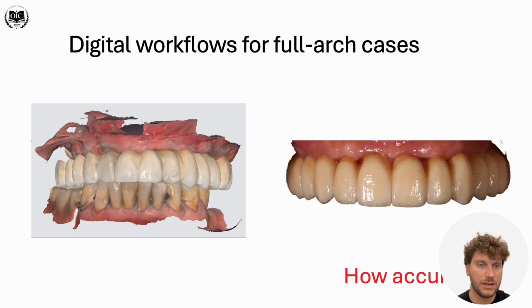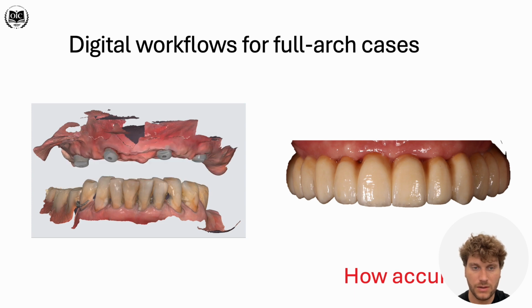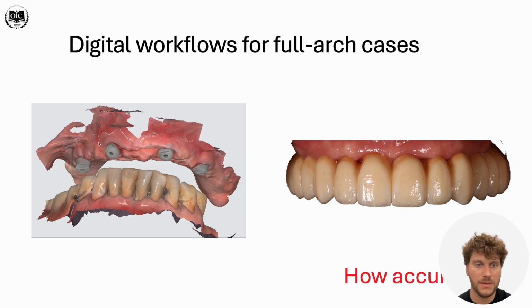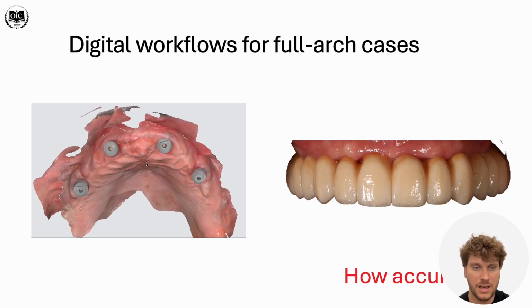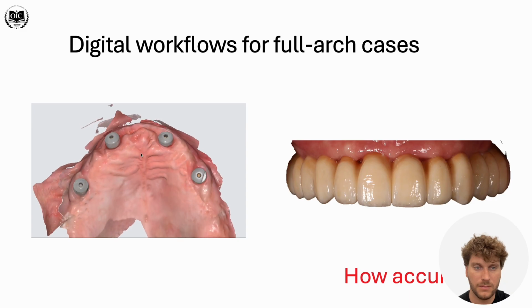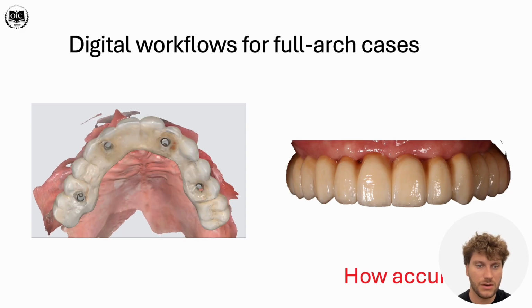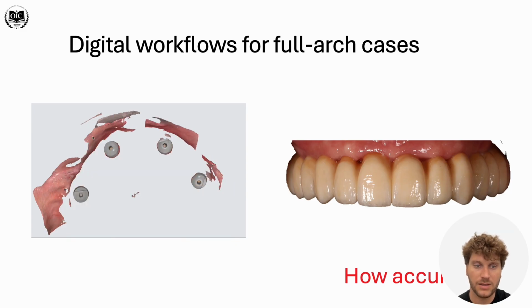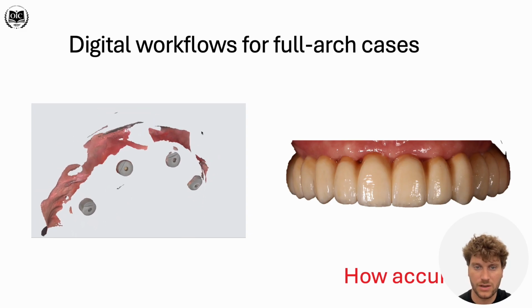So to go through the digital workflow for a full arch case, this is quite pushing the limits of the technologies that we use daily in our practice. We know that scanning implant cases for single restorations or short span bridges is viable, and I think we're getting to the point that there is no discussion about what to choose, digital or analog.